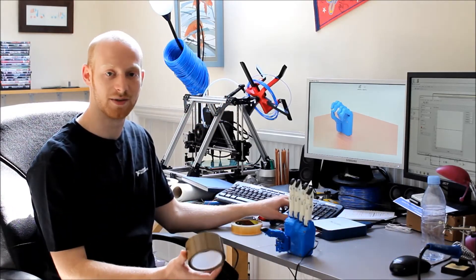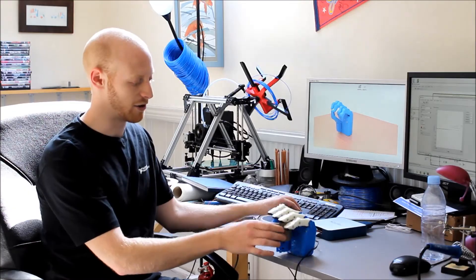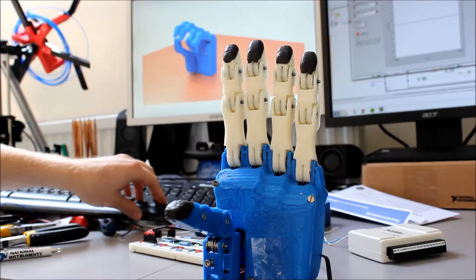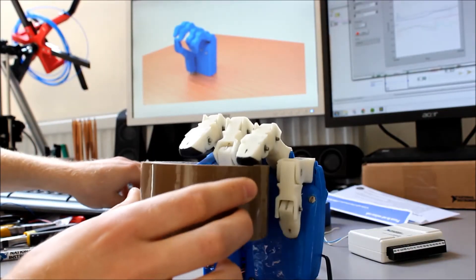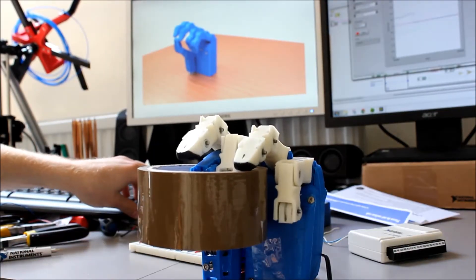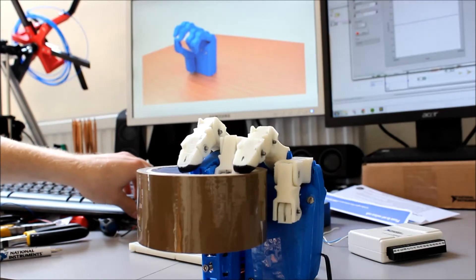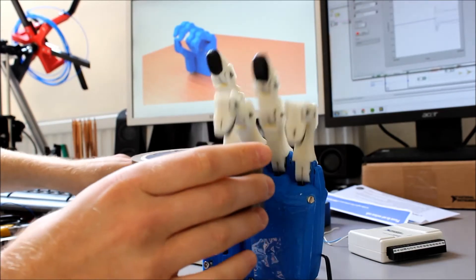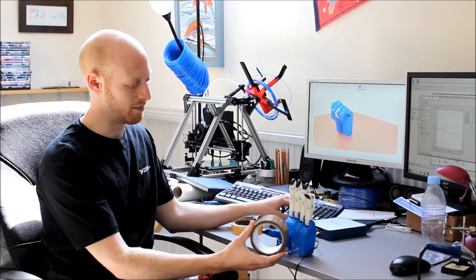So we can see it grabbing a few different types of objects here and how the grip can handle all sorts of different shapes. So if it's something like this roll of tape, then it'll get in between the gaps and grasp it firmly.